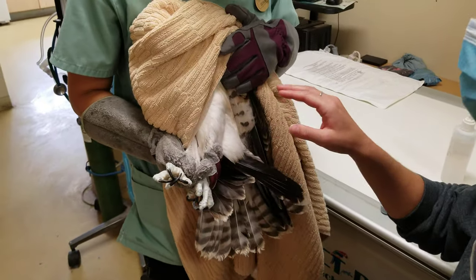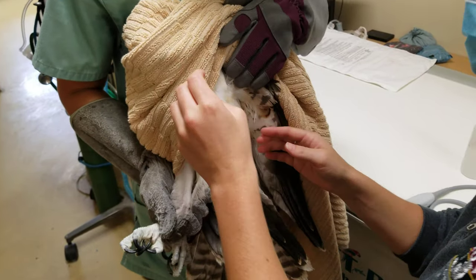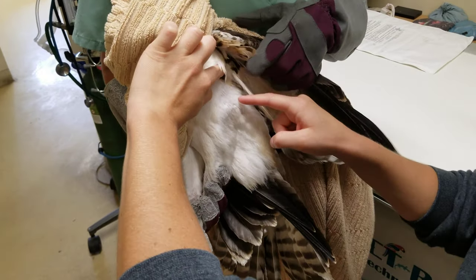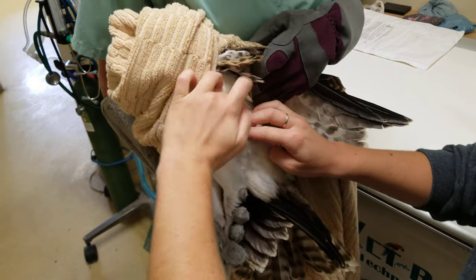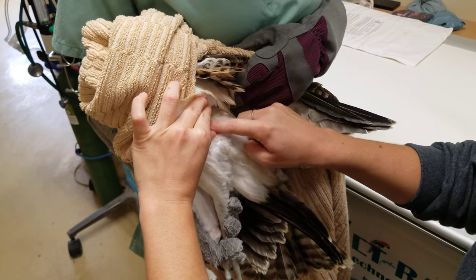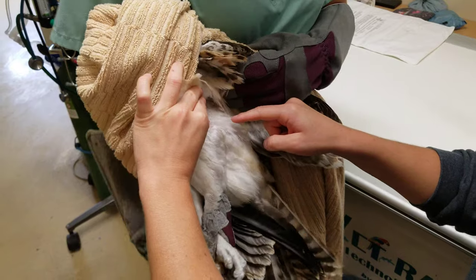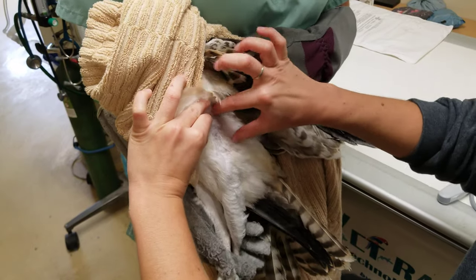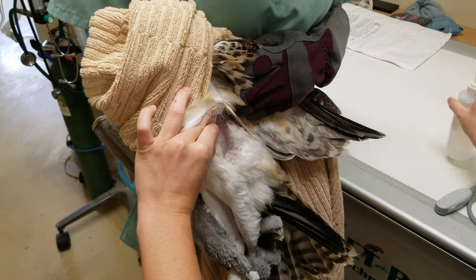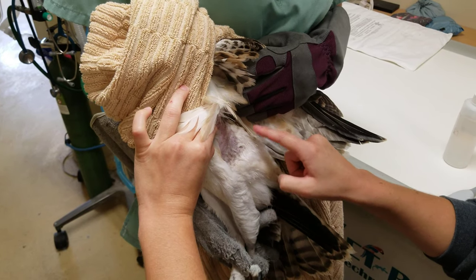We're going to be looking at the left side, so we're going to have the bird turn to the left side towards you. We're starting with the left shoulder right here and then the left femur. In between there, you can actually move these feathers aside and palpate all the intercostal spaces that we want to scan. We're going to have our holder pull the legs down — you'll see how much more that opens up our field. Here's our shoulder, here's our femur, and here's our ribs.